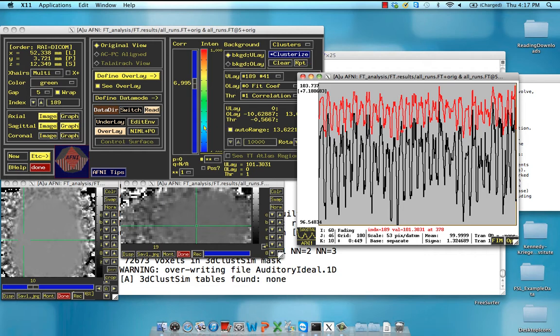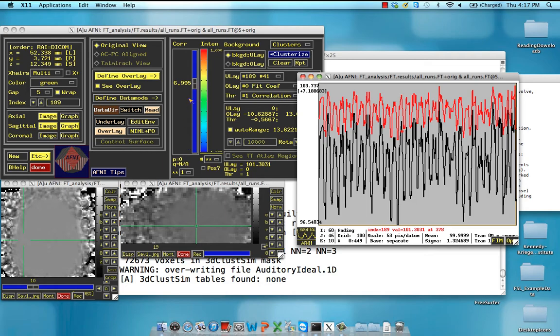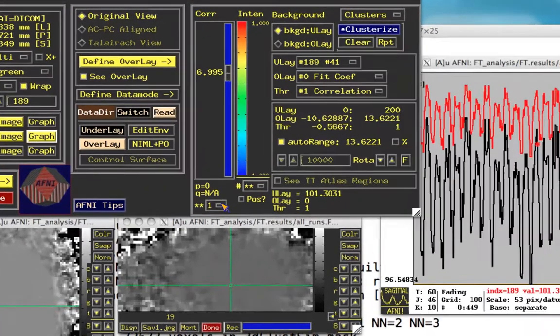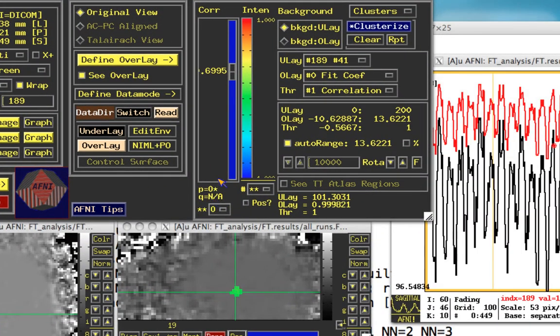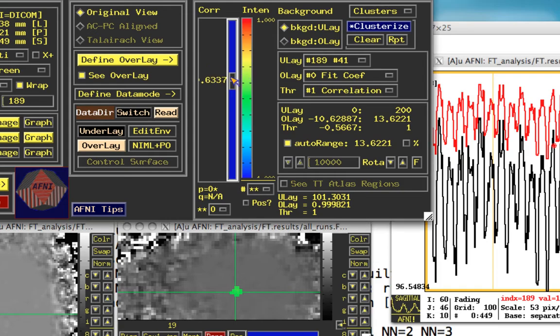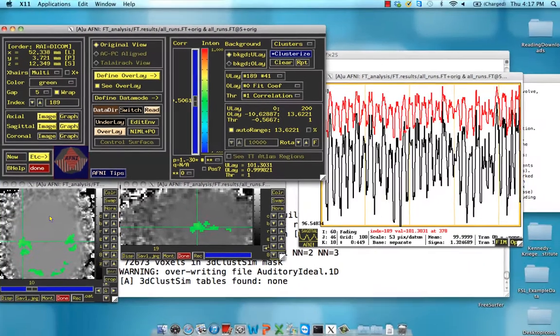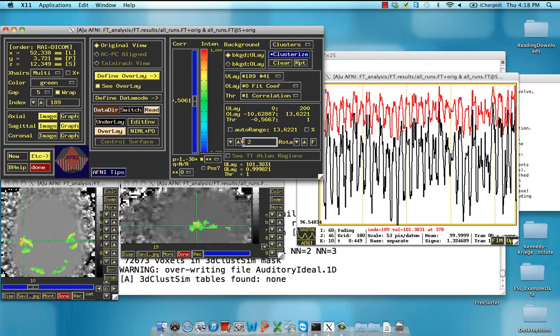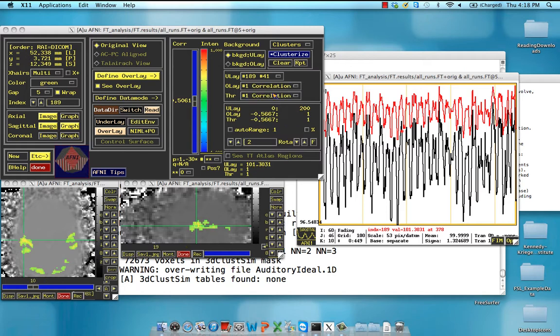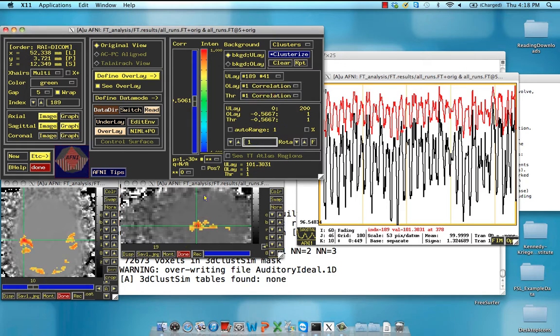And notice here now that this slider is now a correlation. So obviously we can't go above one or negative one, and we're going to bump this threshold down a little bit. Let's just make it 0.5, let's say. So look for any voxels which have a 0.5 correlation with that seed voxel that we tested. Let's make the outer range something a little bit nicer to see. Let's make it a maximum of 2. And then maybe just 1.